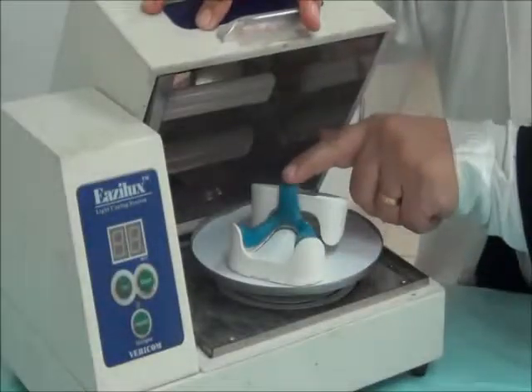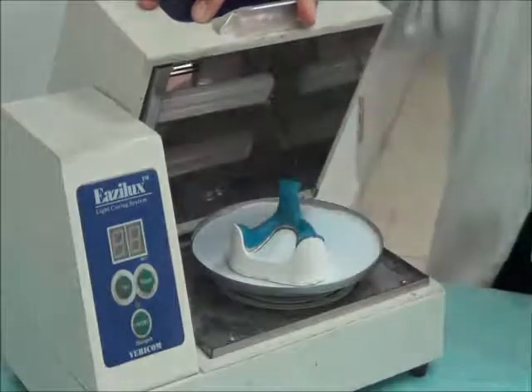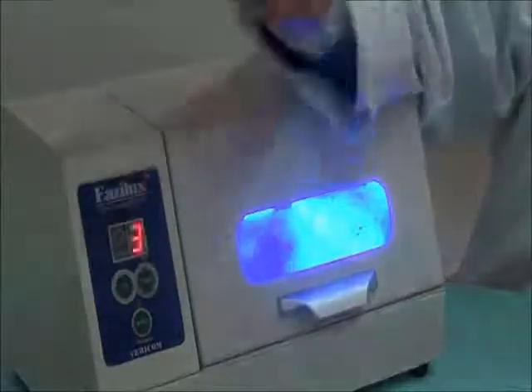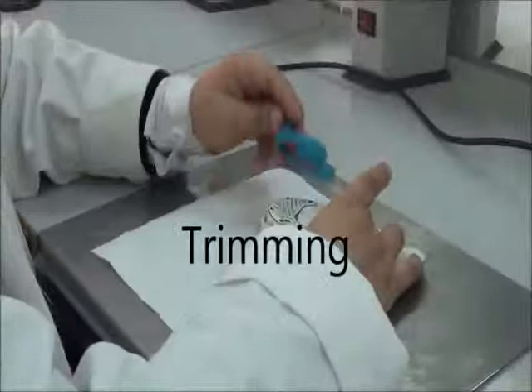Once more. Now it's hard enough. I could remove my support material and then cure it fully till it's finished.